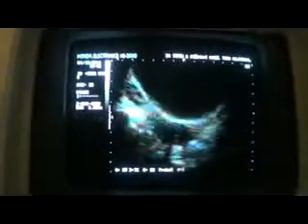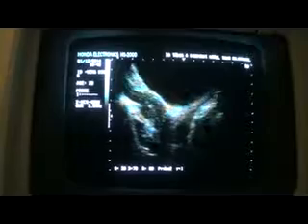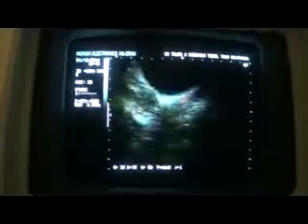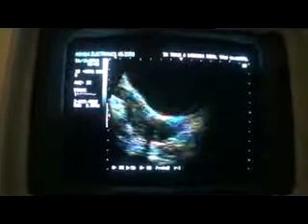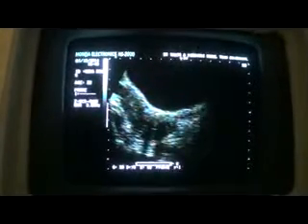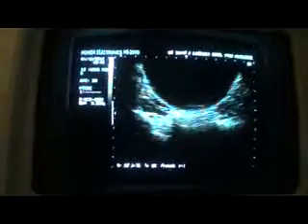So two vagina, two cervixes, two uterine bodies, two separate uterus, two vagina. Again, favoring our diagnosis of didelphys uterus with bilateral polycystic ovaries.